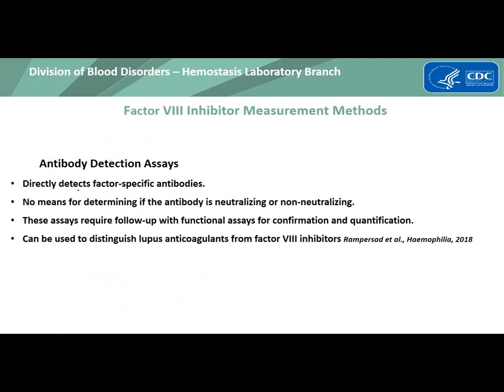So although the antibody detection assays can directly detect antibodies, they do not, though, have a means for determining if the antibody is neutralizing or non-neutralizing. And so because of that, these assays do require a follow-up with a functional assay for confirmation and also for quantification.